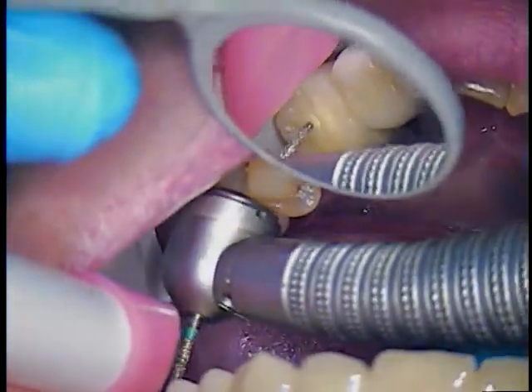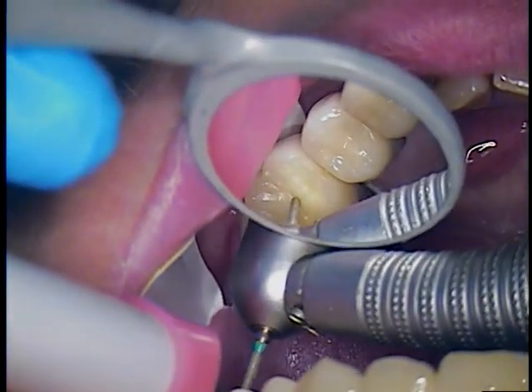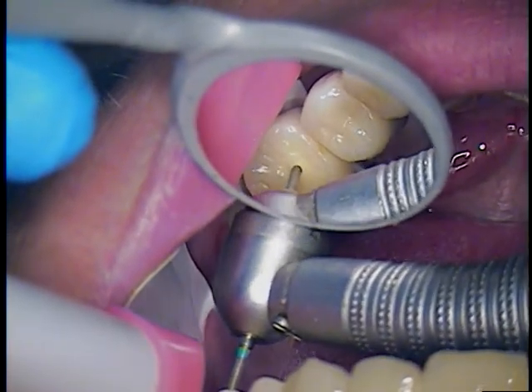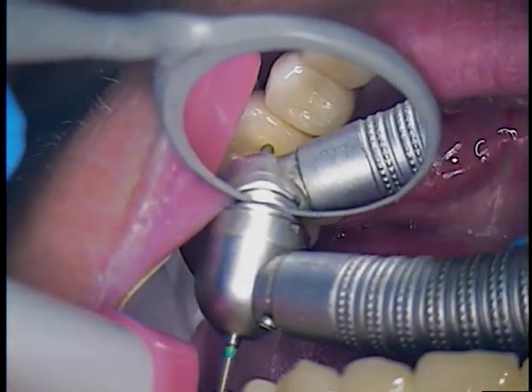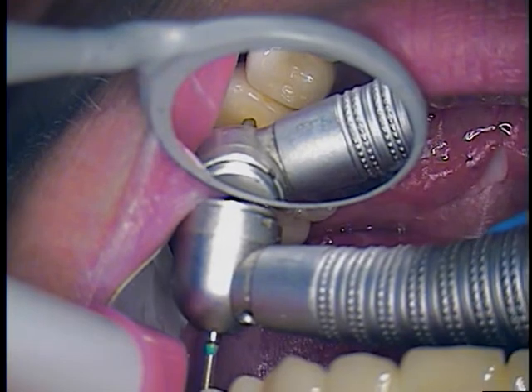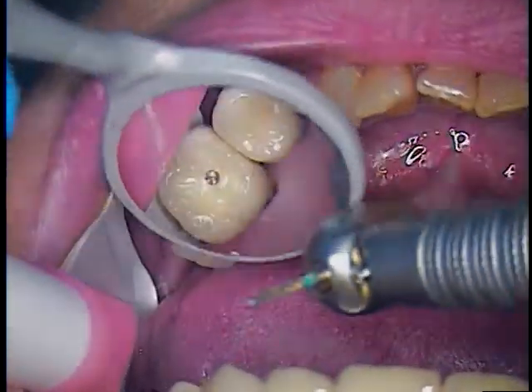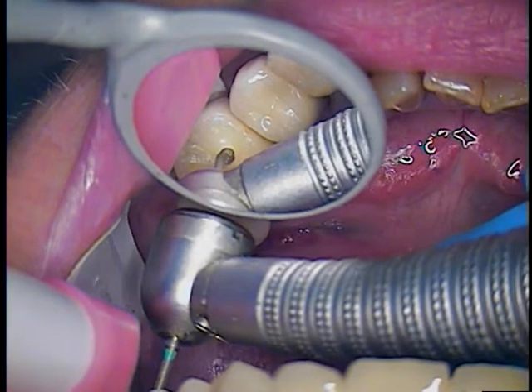Debra, open up just a little bit, thank you. We'll go right about here, and we'll just go in gently — we're already touching metal, so maybe that's a good thing. I'm going to try to keep the access hole the normal diameter, and we may have to search for the internal chamber. I'm going to go distal just a little.